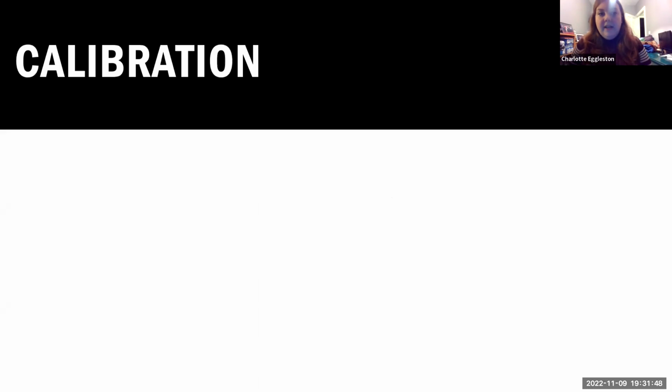So we've done the name and everything. For the calibration, your key numbers are 25 millimeters per second and 10 millimeters per millivolt. Standardly, that's what most ECGs are already set to, although I had a bradycardia in A&E the other day where the calibration was wrong. If you calculated the rate, which we'll explain how to do in a second, the rate came out at 20. I was quite alarmed when I read the ECG, but it was miscalibrated, so it wasn't as catastrophic as it at first looked. I had to do another ECG after recalibrating the machine.